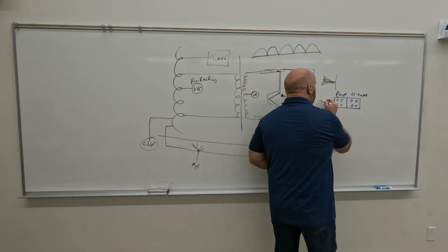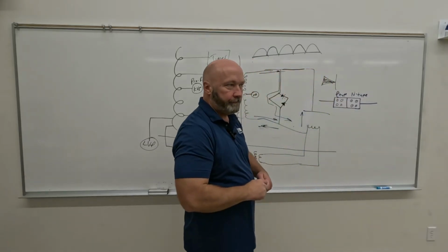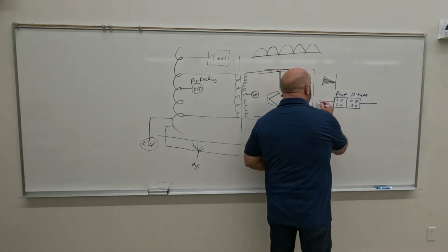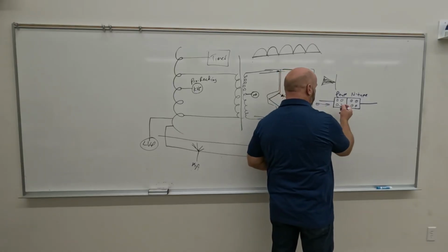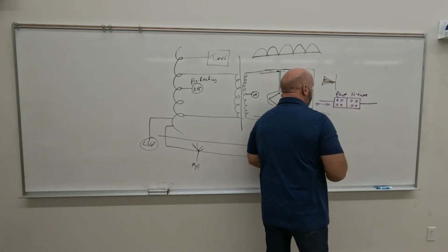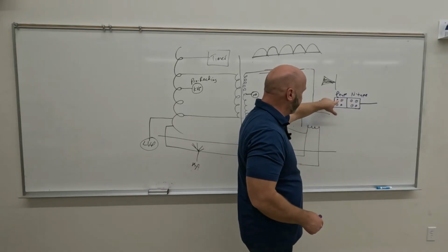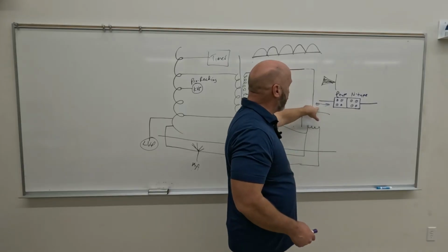And then think about how charges behave. Okay, so opposites do what? Attract, right. So if I apply electricity going this way, and these are all negative, and these electron holes are then positive, then what's going to happen between the p-type side of the rectifier and the electrons?